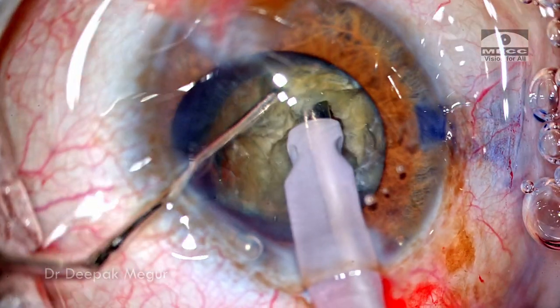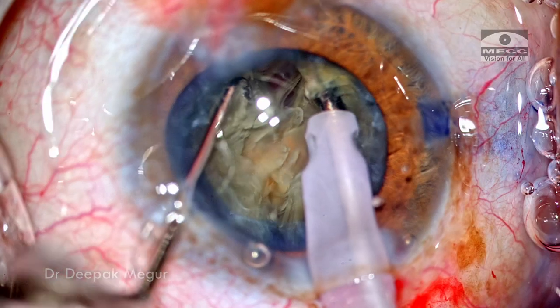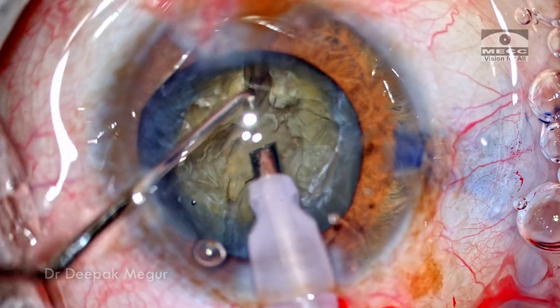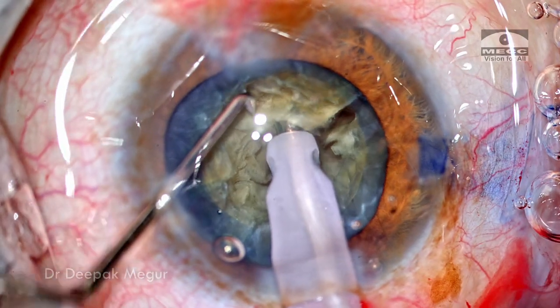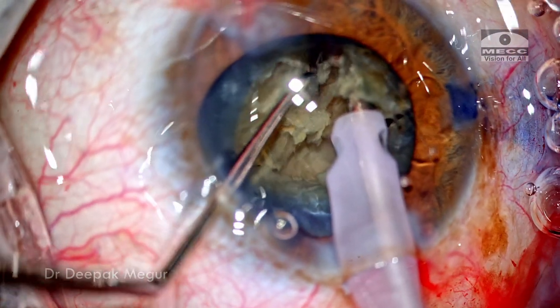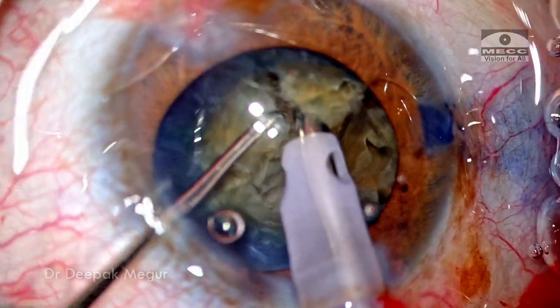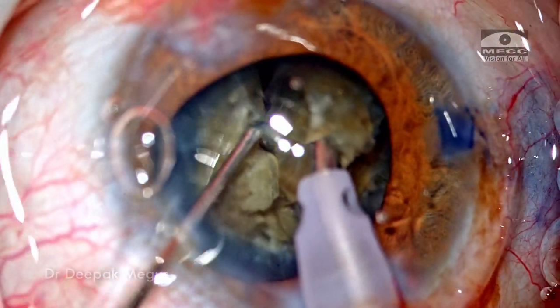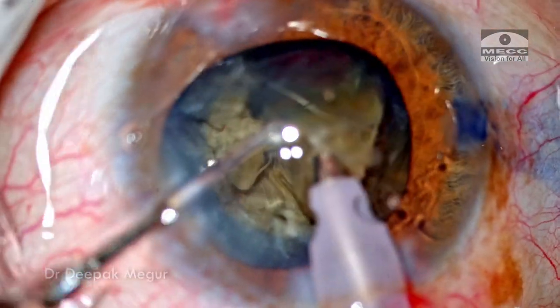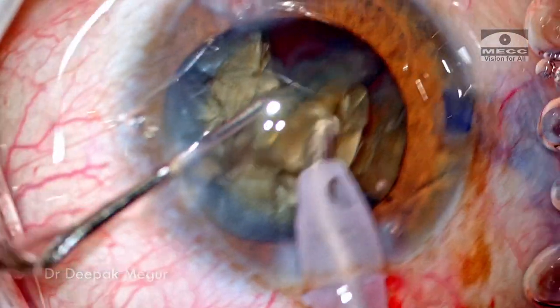I'm using a sharp vertical chopper — the chopper goes down and then laterally separates. As we can expect, this is a dense nucleus and separation in a single stroke is not possible. A couple more attempts of re-gripping and lateral separation maneuvers are required to separate the posterior plate. The nucleus is then rotated, the next part of the heminucleus is engaged, and a vertical chop maneuver is performed. We have one free fragment. The tip is buried again, the nuclear fragment is pulled up a little, and the vertical chop maneuver is repeated. Lateral separation maneuvers ensure that the majority of the fragment is free. The fragment is then pulled out of the bag into the anterior chamber above the rhexis margin and emulsified in a controlled manner.